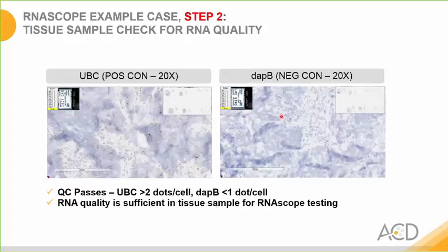In step 2 of the example case, the tissue sample is checked for RNA quality with application of positive and negative control probes. In this case, again, it looks very similar to the previous slide. UBC is clearly positive, so you can see the brown chromogenic dots in this tissue, while the DAP-B is clearly negative, supporting sufficient RNA quality for this particular tissue specimen to proceed with subsequent RNAscope testing.